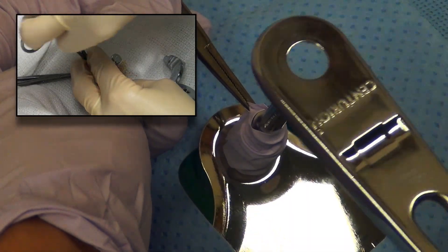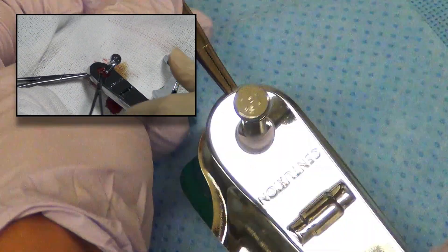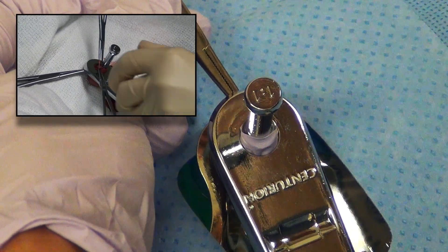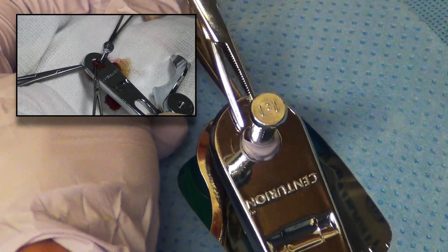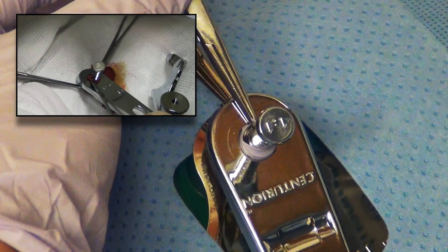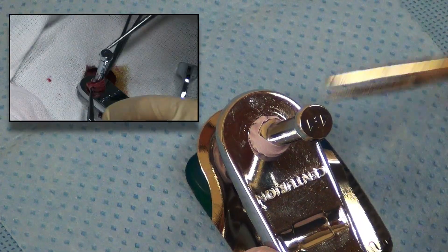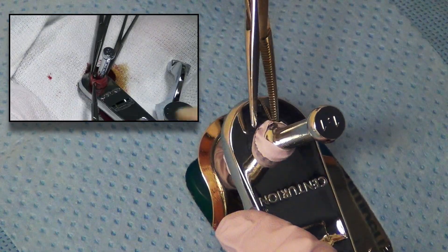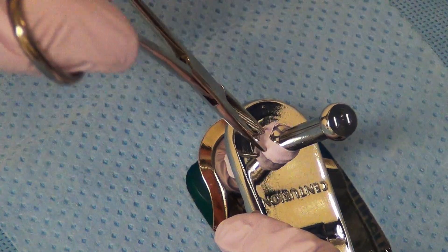Alternately, the foreskin can be secured in place with a hemostat placed through the hole in the base. The foreskin is then pulled through the opening in the base of the clamp until the end of the dorsal slit is reached. The bell protects the glands of the penis.